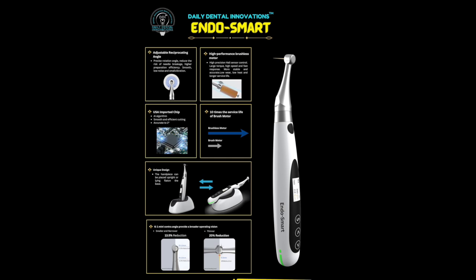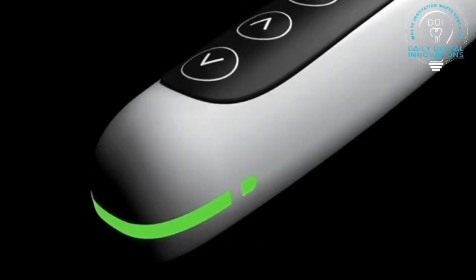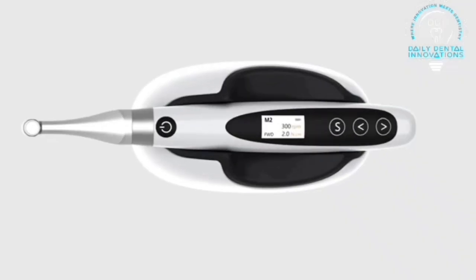Hello friends, this is a continuation video of the review of products from Daily Dental Innovations. In this video we are going to review the EndoSmart endo motor. At the outlook, the product looks nicely finished and also looks premium.